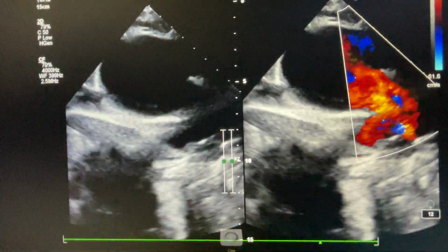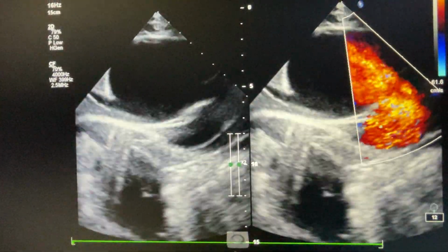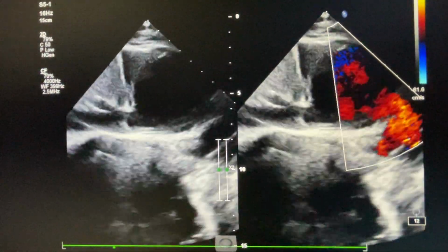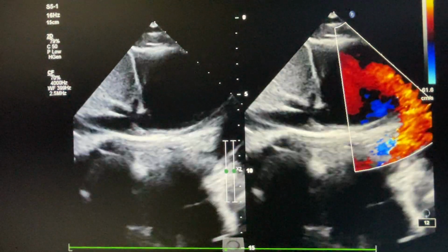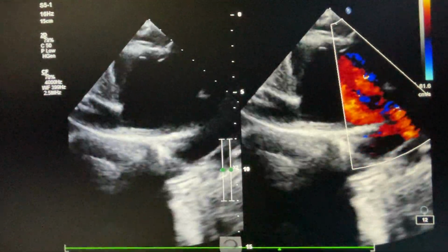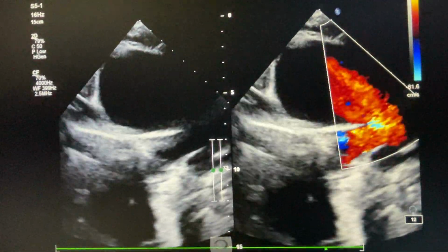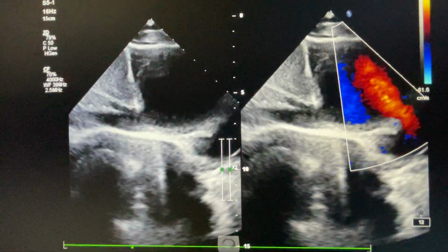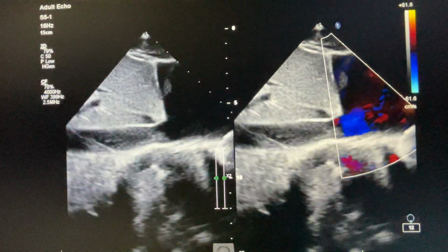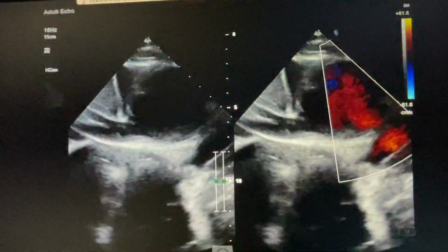A little bit of movement will give you this image. You can easily find out sinus venosus ASD of SVC type or IVC type also. But as IVC type is very rare, SVC type is commoner than IVC type. So you will get SVC type of sinus venosus ASD.